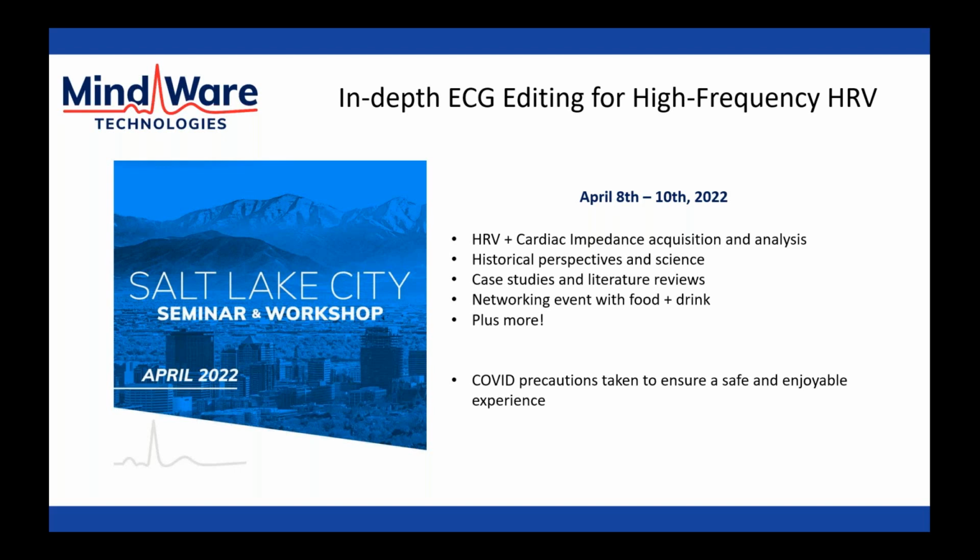So our scientific advisors, Dr. Gary Burnson and Dr. Greg Norman, are going to be presenting. We're going to talk about historical perspectives, we're going to go in depth into the underlying mechanisms that we're measuring, and then we're going to have a hands-on practicum where we collect the data, where we actually go through examples, we analyze it, and one of the best parts about this is something that we've missed greatly, which is the ability to network with researchers from around the world that attend this event.